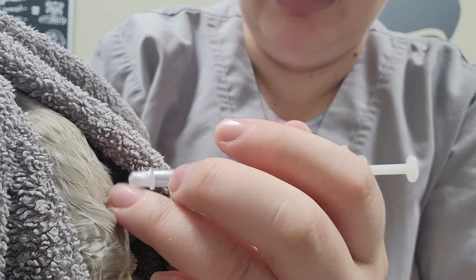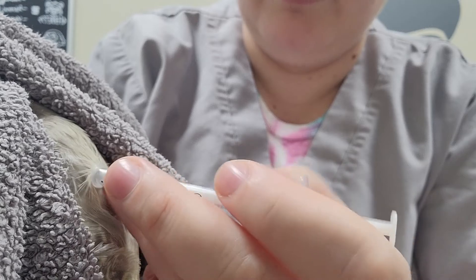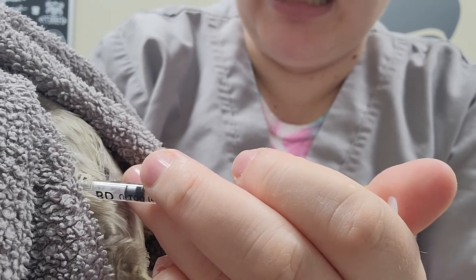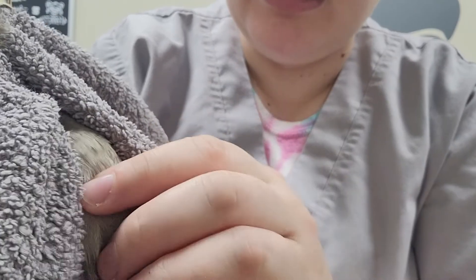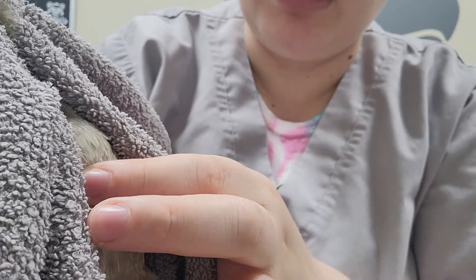Go to the keel, step off to one side, pop in — and you don't have to go very far. Pull back on the syringe to make sure you're not getting air or blood. Once you know that, go ahead and give your injection. There might be a little bit of bleeding at the area — that's perfectly normal. Just put a little bit of pressure on it.